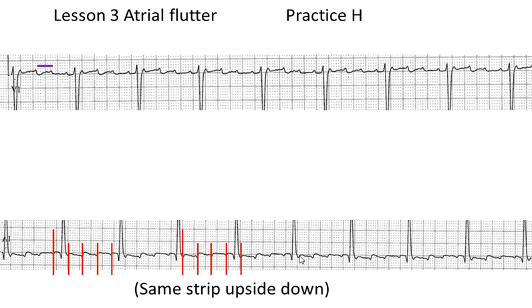We want to remember that flutter waves continue under T waves and under QRSs. The atrial flutter waves are occurring in the atria and have nothing to do with the QRSs and the Ts, so they're going to be landing on top of each other — two things happening simultaneously.